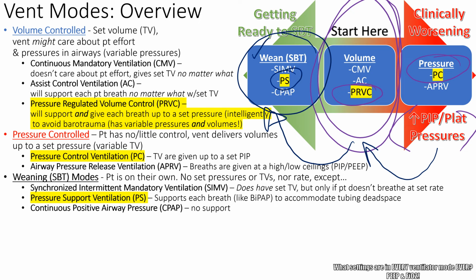That's not the mode they're on. They're on pressure support ventilation, okay? And we'll point that out. And SIMV was retired in the 90s. You might see some people that get it for hiccups. You might see it rarely here and there, but it's not a mode that's utilized, okay?